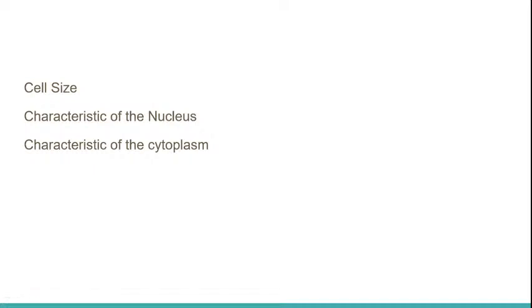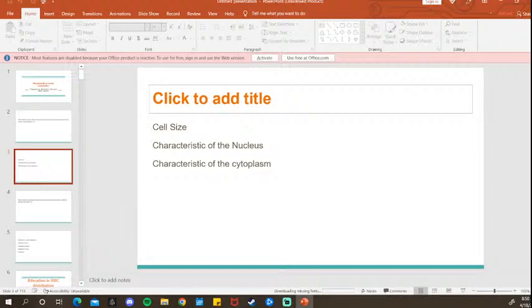I forgot to mention also the difference between a macrocyte and a megaloblast. A macrocyte is oftentimes caused by vitamin B12 deficiency and folate deficiency, but most of the time it does not present itself as having hypersegmented neutrophils.